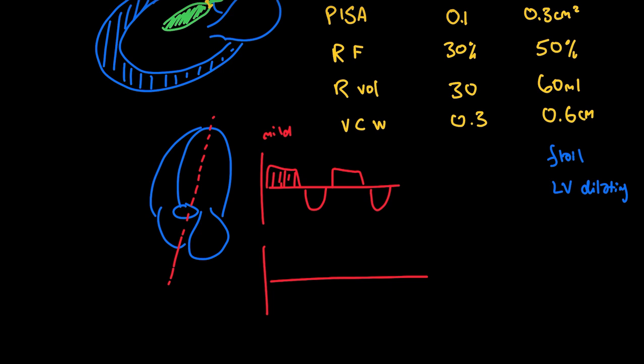Now severe leak, on the other hand, would look like this. You'll see steep downward, very bright. And then over here you've got your normal flow, and then here again you've got your steep downward and normal flow. And I'm just going to shade in the normal flow as well, because you should have plenty of blood flowing out. Normal flow.